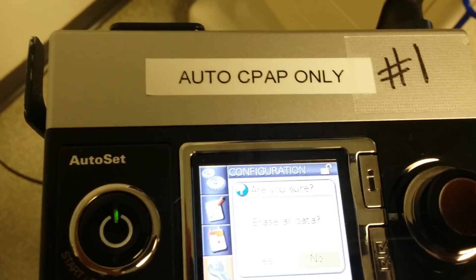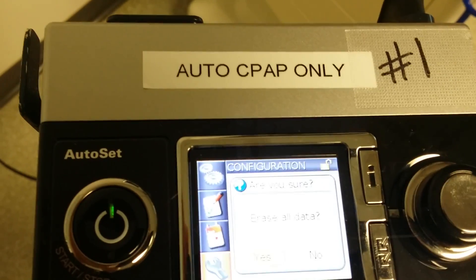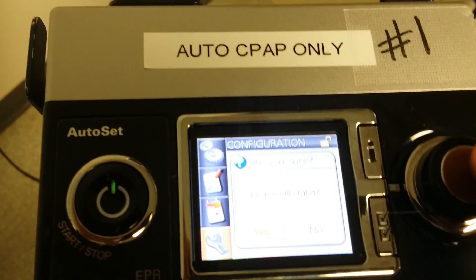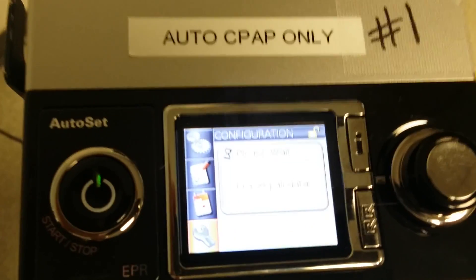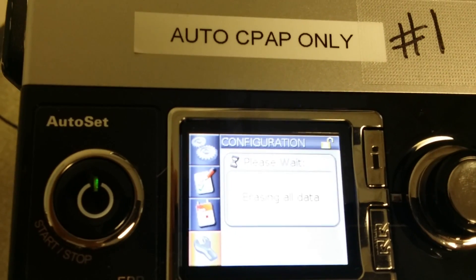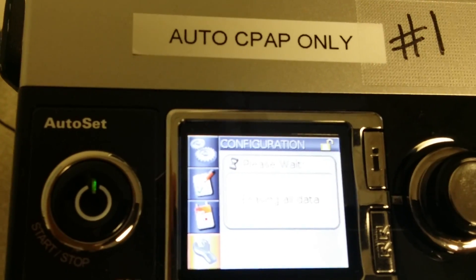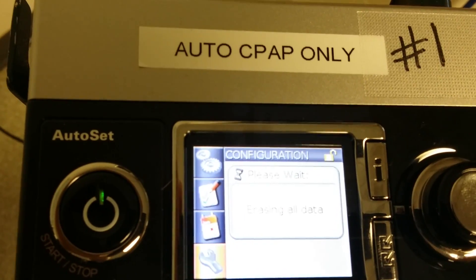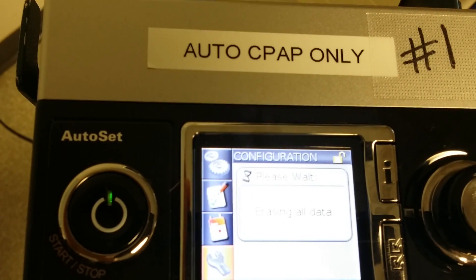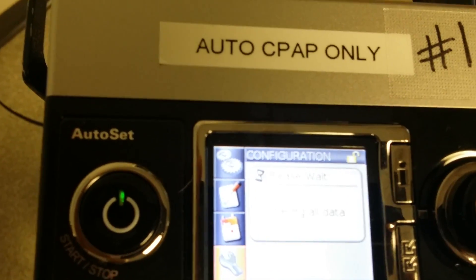It's going to ask 'erase all data' and you want to say yes. Turn the click dial until you see yes, then click to accept that. Now it says it's erasing all data — this is erasing all the information from the previous patient. Just wait until it's all done; it doesn't take too long depending on how much data is on there.